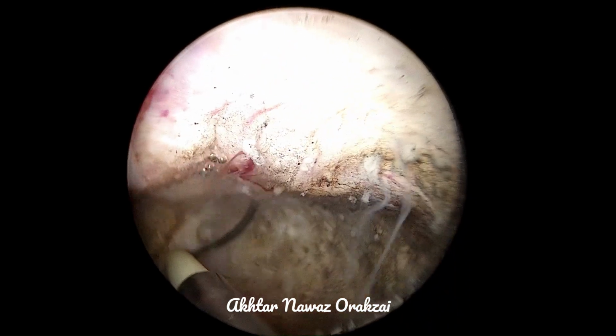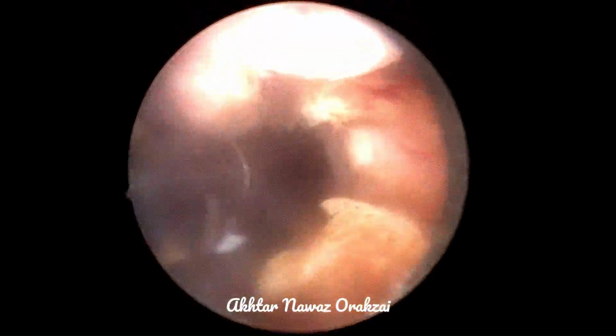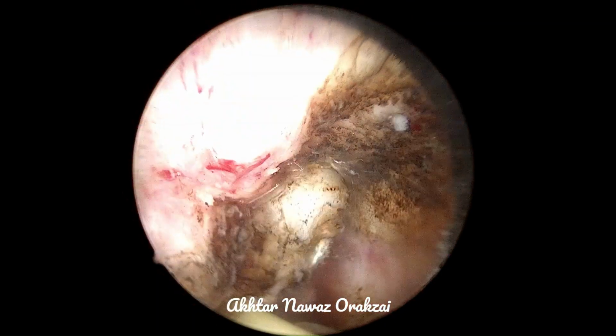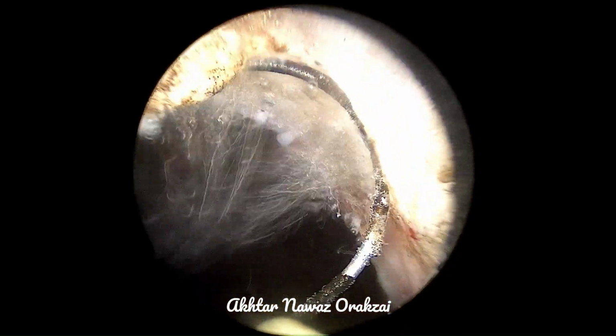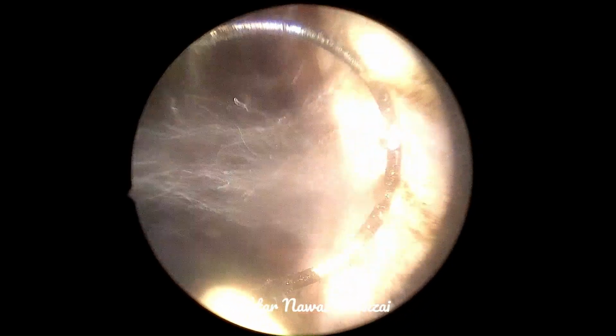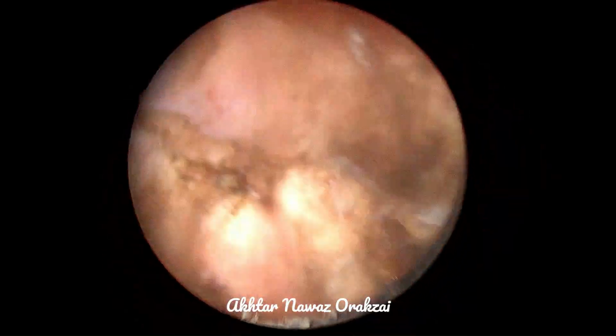This is also because this is an educational video and we need to see the prostatic cavity so that the beginners and learners can see the cavity as a whole. This brisk bleeder needs to be coagulated there and then.